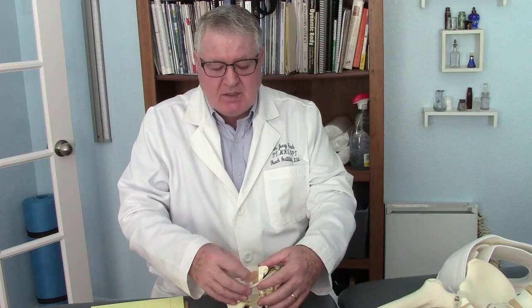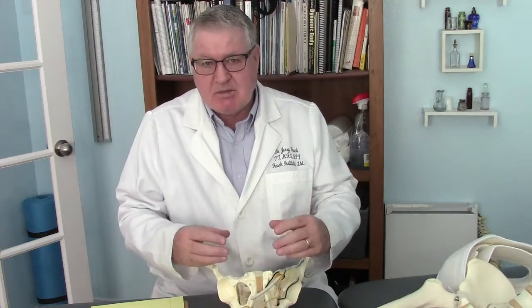If you read the sacroiliac literature, then you'll find that sacroiliac supports are very positive in a large part of the population, but the population with pubic involvement, where the pubic joint hypermobility is primary, responds much better to low placement. And again, due to variation in anatomy, they don't all follow the rules, and therefore I think we should try placement low and placement high and see what that individual requires.